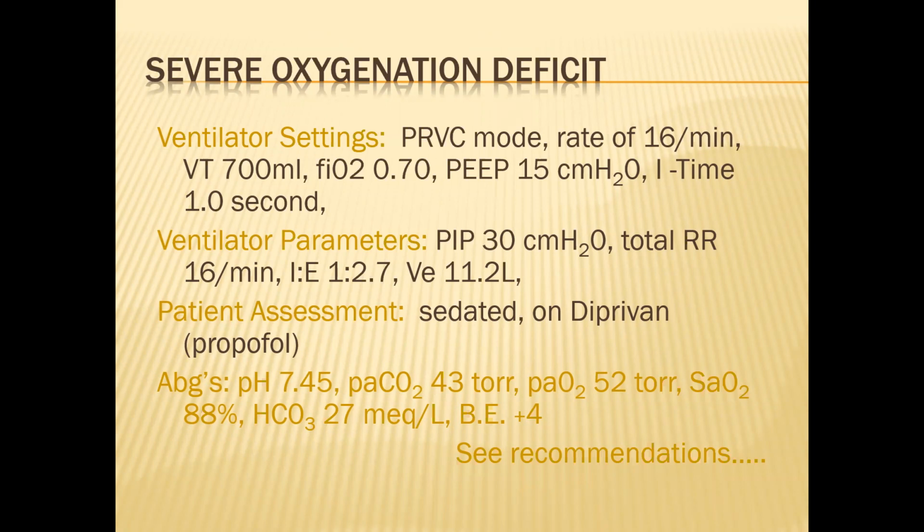If you have a peak pressure of 30 and a plateau of 28, so you don't have much airway resistance, but you have stiff alveoli.